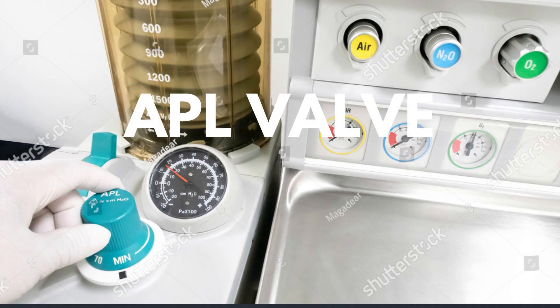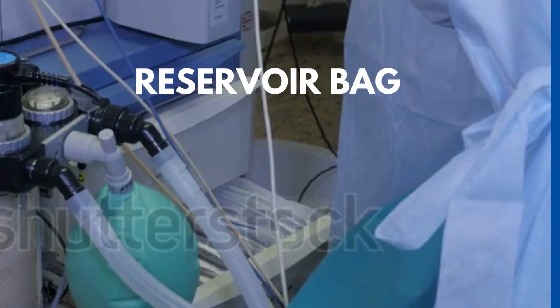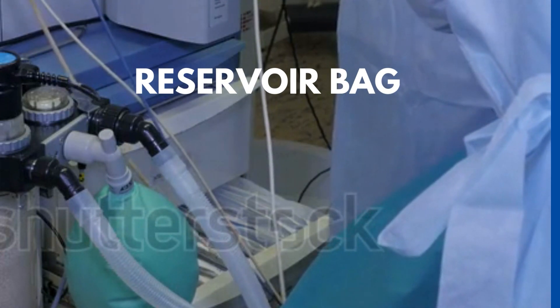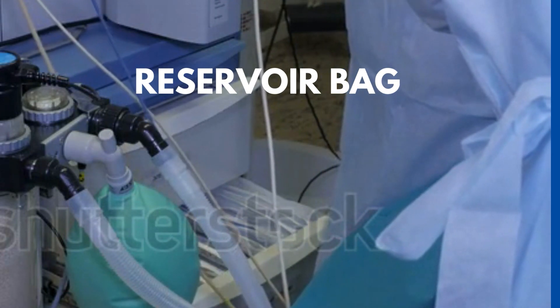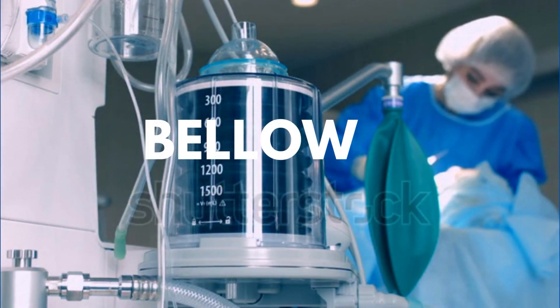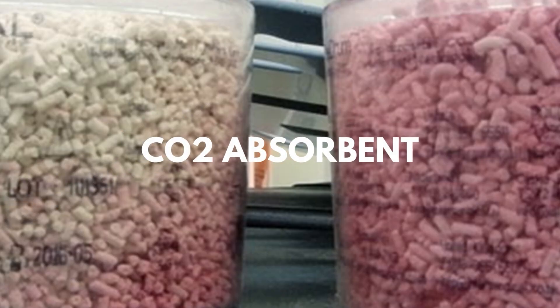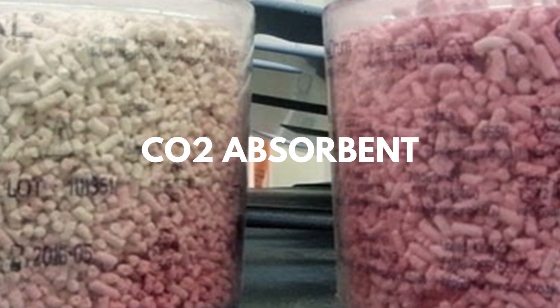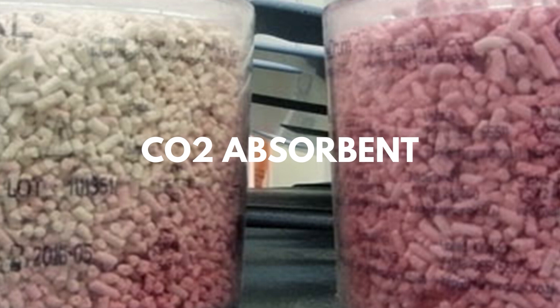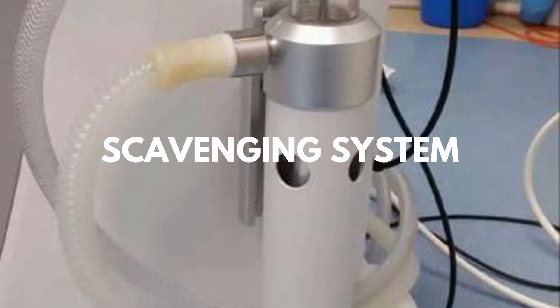A pressure relief valve reduces pressure build-up in the breathing circuit to avoid barotrauma to the patient's lungs. A reservoir bag inflates and deflates during inspiration and expiration, helps in assessing respiratory rate, and also allows manual breathing. Bellows compress when oxygen is directed into the breathing system. The CO2 absorbent absorbs carbon dioxide from exhaled gases and contains soda lime calcium hydroxide.